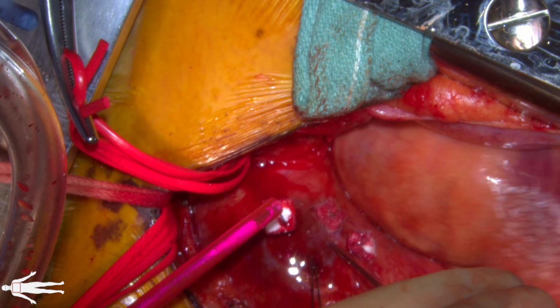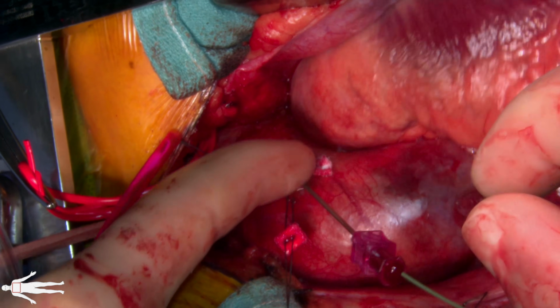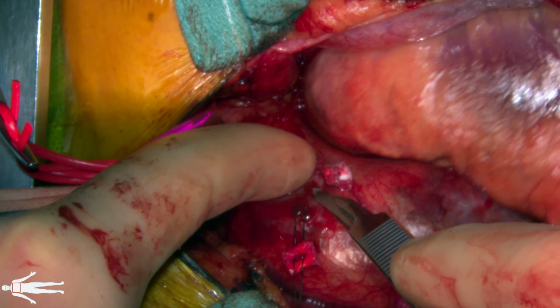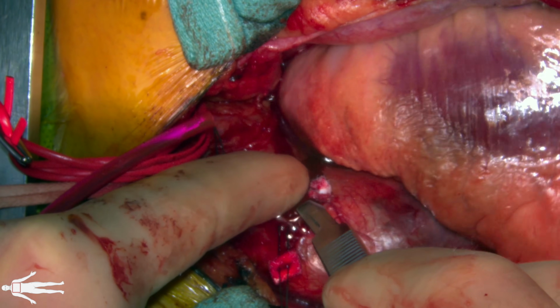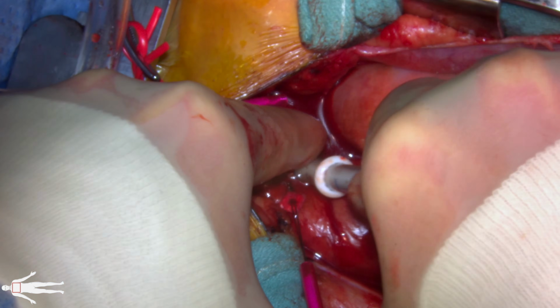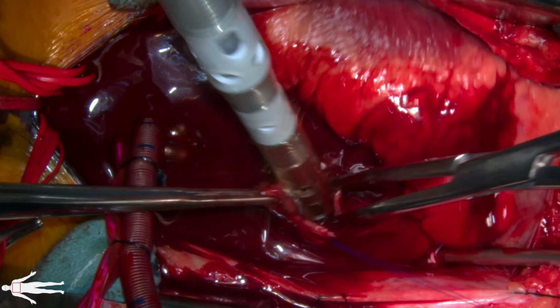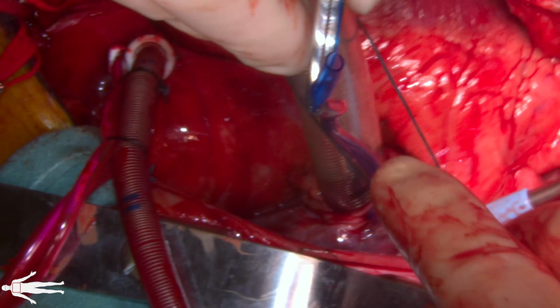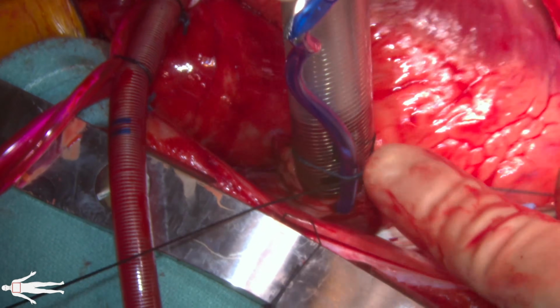Systemic heparin was administered. Once therapeutic, the ascending aorta was accessed using a Cook needle. A Benson wire was then directed into the true lumen under TEE guidance, and a 22 French arterial cannula was inserted over the wire. The right atrium was cannulated with a multi-stage venous cannula. Cardiopulmonary bypass was then initiated with a cooling target of 25 degrees centigrade.